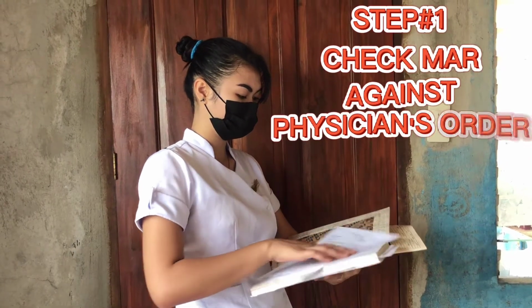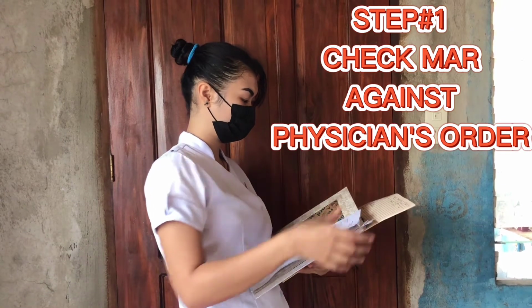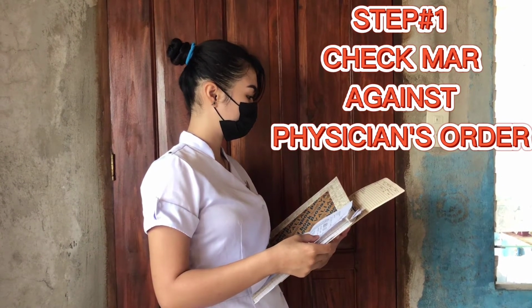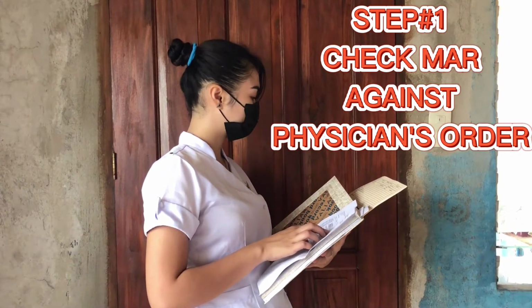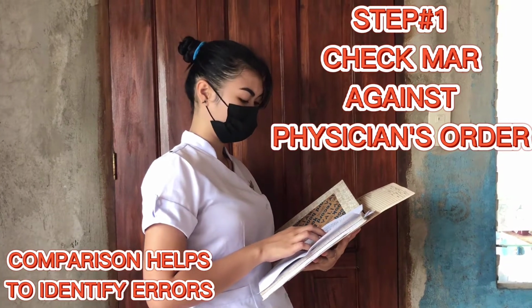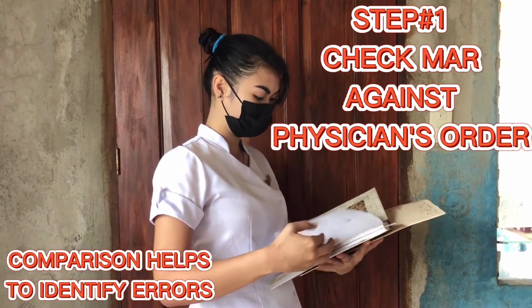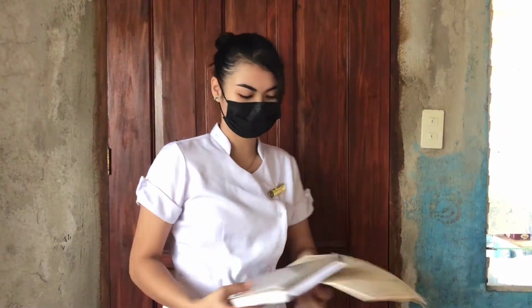Step number 1. Check medication order against the original physician's order according to agency policy. Clarify any inconsistencies and check the patient's chart for allergies. This comparison helps to identify errors that may have occurred when orders were transcribed. The physician's order is the legal record of medication orders for each agency.